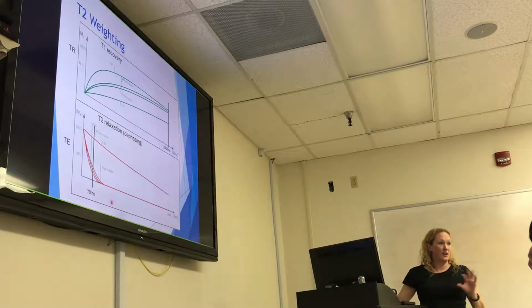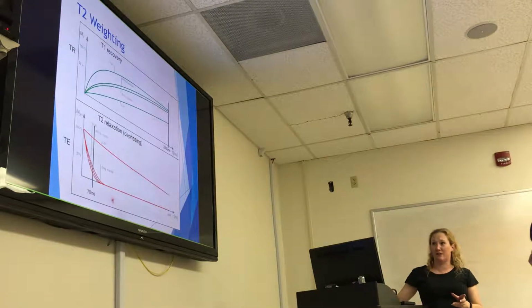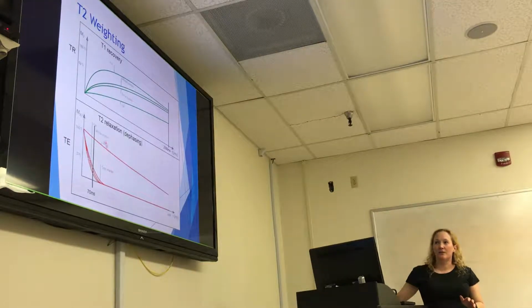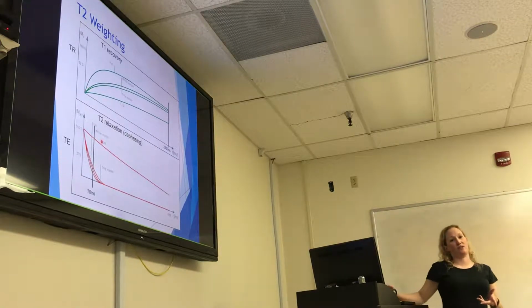So that's why I say it's relative to itself, all right? A long TE is around 70 milliseconds, whereas a long TR is like 2,500 milliseconds, okay? So don't compare them to each other, all right? Just try to think of them as separate. But here again, you can see we have really, really good T2 differentiation between these tissues because we waited long enough for the dephasing to occur, all right? Questions on that process?